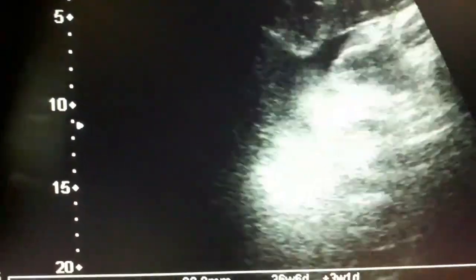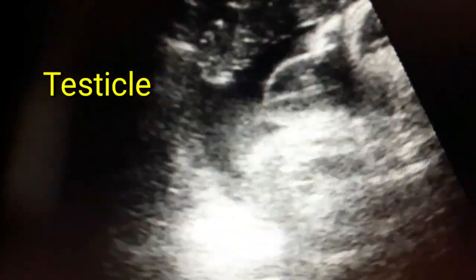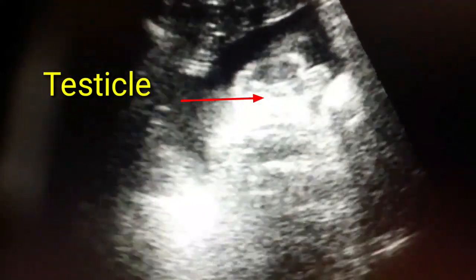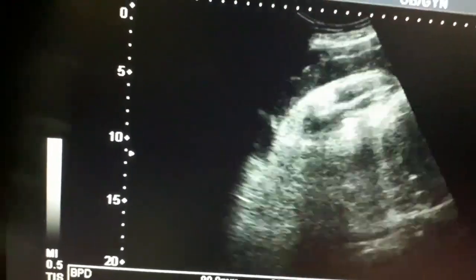This is the testicle and it is just below the placenta. Look at both testicles — the right and left testicle. This is the scrotum and there is the tip of the penis as well. You can appreciate that, and this is the fundal part of the placenta above the testicle — a very clear image of the testicle. So it is a male baby.